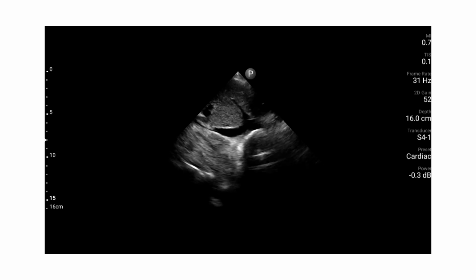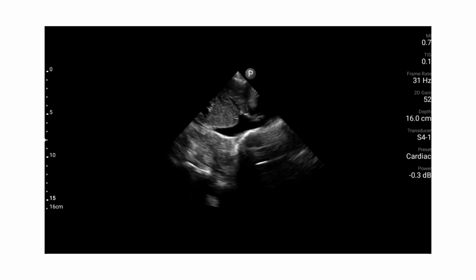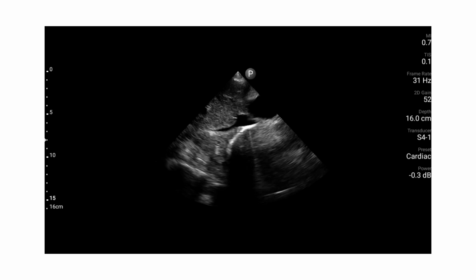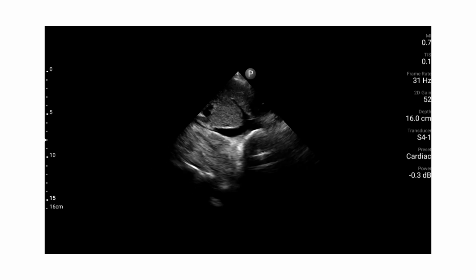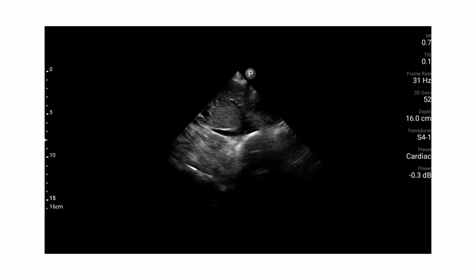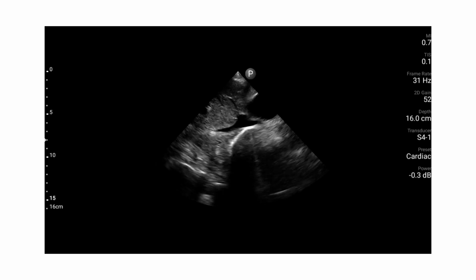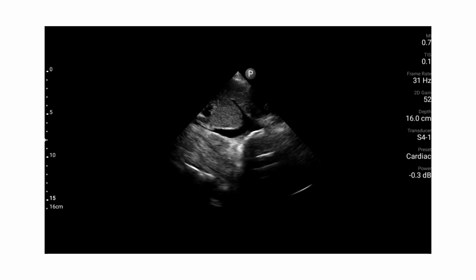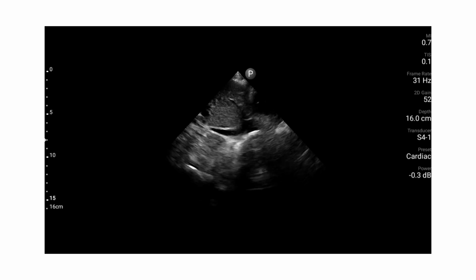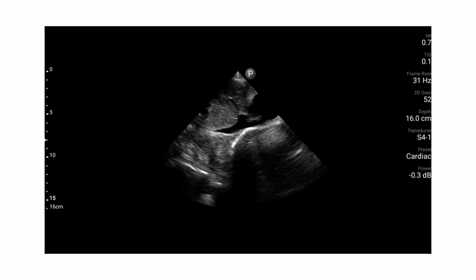And so here's an example of a collapsing IVC. So again, without even looking at many IVCs, maybe you're a novice, you've never even touched an ultrasound, you can look at that and you can see the IVC is small, and then on spontaneous breaths, it is completely collapsing. This patient's not doing a sniffing maneuver. This is just spontaneous breaths that are causing the walls to collapse. You can see the heart beating, and you can tell that my heart rate is very high.